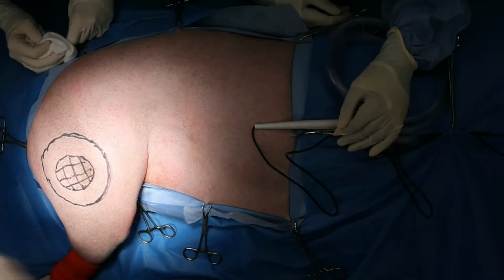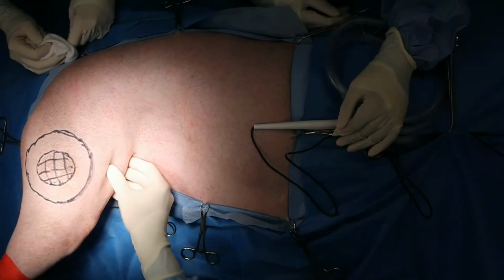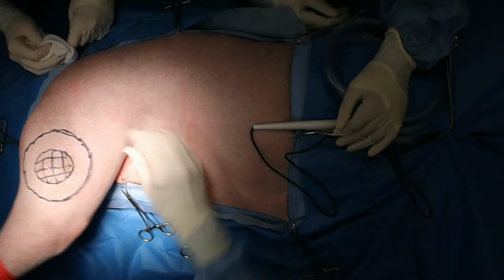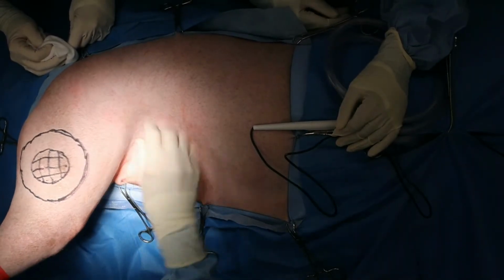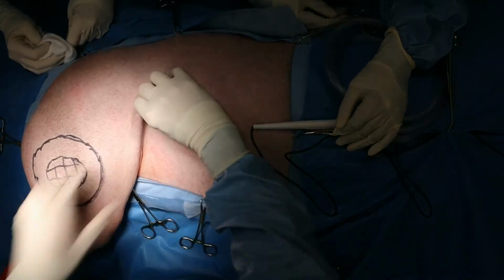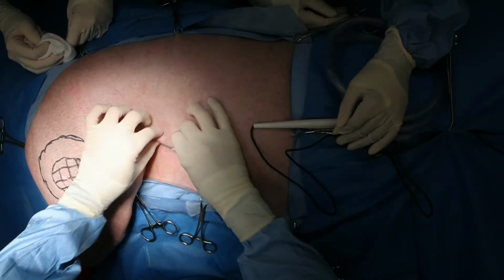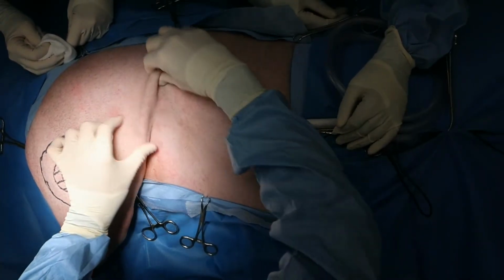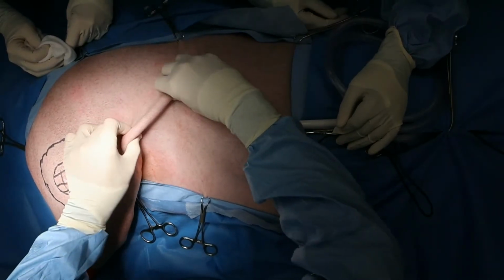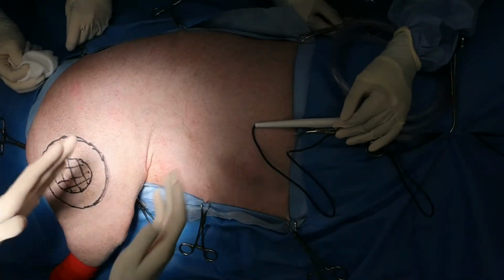And in order to close this, we're going to have to do a flap, and probably a flank fold flap is what I'm thinking. And so we've clipped quite a bit so that we can bring a flap of skin back down to here and close the defect. And I think the flap is going to be oriented in that direction like that. So you want to orient the flap in the direction that you have the most skin at the donor site so that you don't put the closure of the donor site under tension.